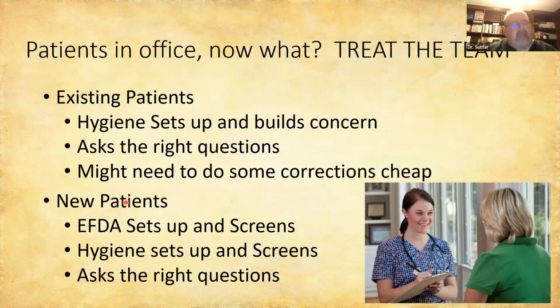The other thing is, and most of the profession is ignorant of this fact, occlusion does change, just like your periodontal status, just like your decay status. And so what are you going to do? Mount models once a year to check this out and confirm what you think you know? No, you're going to use a $7 or $8 sensor. And in less than a minute, you're going to have a ton of data so that you can talk intelligently. Hey, Mrs. Jones, the bite looks stable. I don't really see a change. It's like 5% variation from last time. Or, wow, it's no longer 50-50.